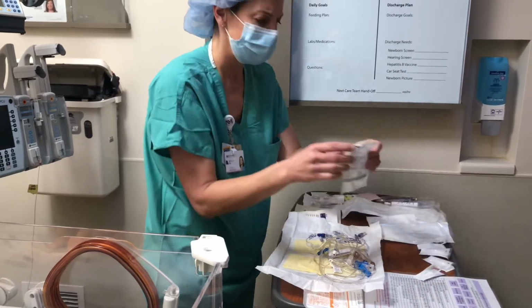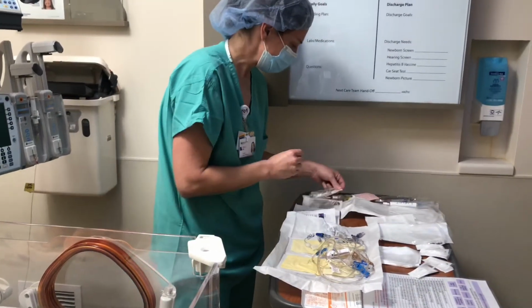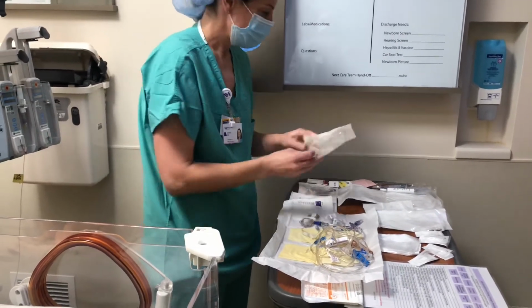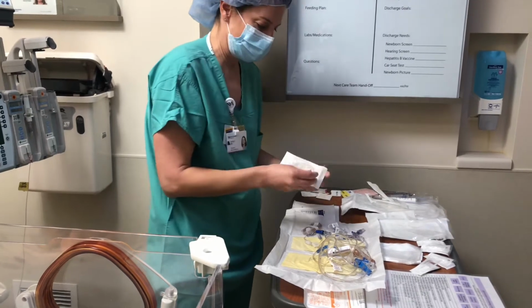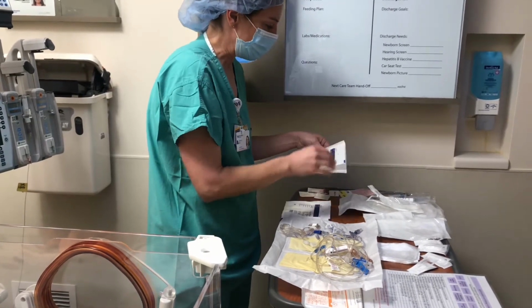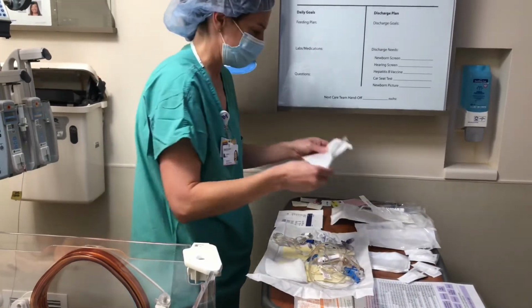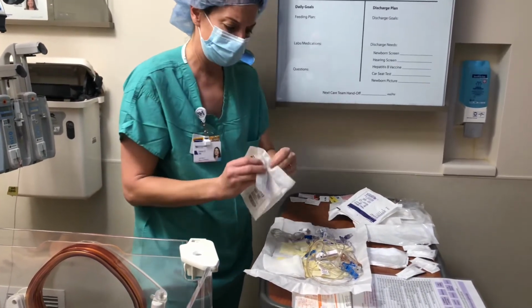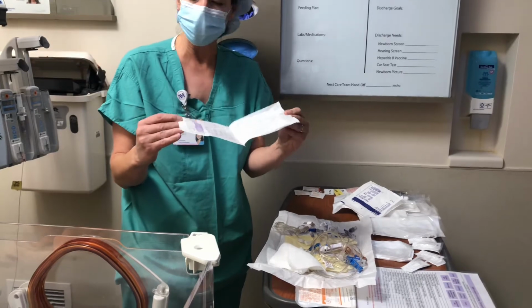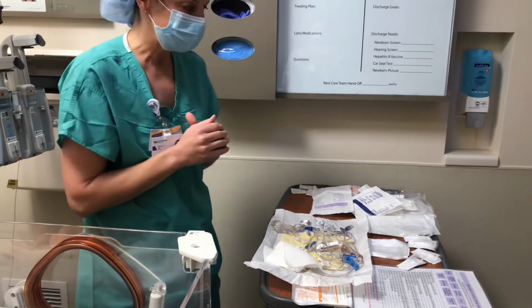And my bifuse or my Y port. Okay, and then I'm going to open up my medline tubing and my lipid tubing, which again is the same microbore tubing. Then I'm going to need my 2 packages of my 4x4 gauzes, and you can rearrange these once you have your gloves on. And I'm going to reserve one of these packages because I'm going to use this later to put underneath my clave when I'm doing my dressing change.